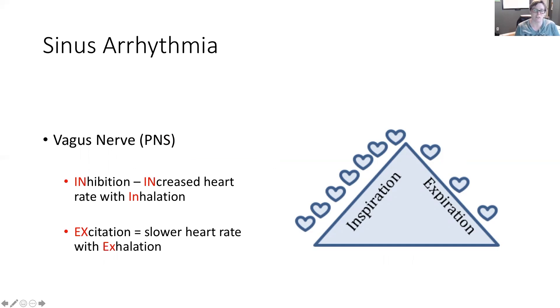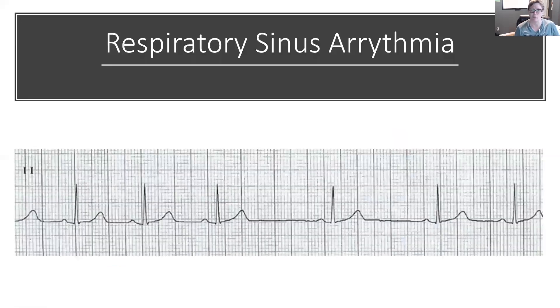You may have noticed this on yourself or others — if you've taken someone's pulse and it's really fast then slows down, then fast then slows down, that's what it's going to look like on a rhythm strip. On this respiratory sinus arrhythmia ECG tracing, it looks pretty normal: P waves are round and upright, QRS is narrow, T wave is round and upright. The P, QRS, and T complexes repeat normally — but then all of a sudden there's a really long gap.